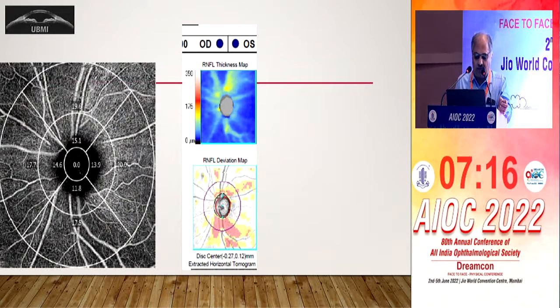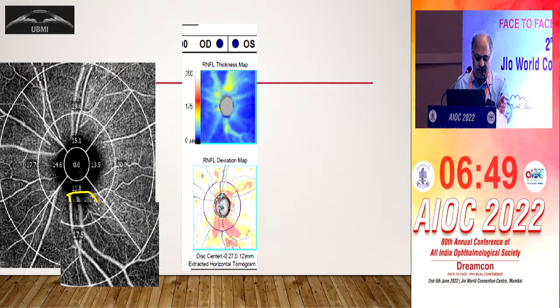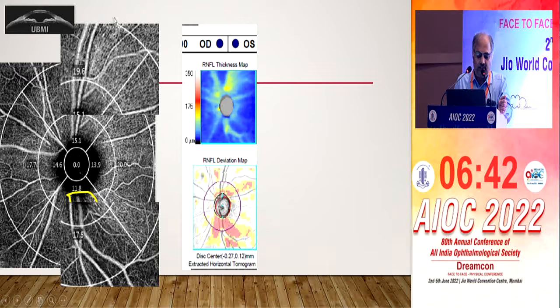Another case, actually, of the glaucoma on the other eye of this patient, you have a structural change seen on OCT. And does it correlate with what we see on angio? Yes, it does. If you see, you can see the branching vessels over here, but the radial peripapillary capillaries are seen at this edge from this edge. It is not seen in this particular area, but it is seen superiorly. So this is the area where it is deficient. I have just enlarged this image to show that you can see only the superficial plexus and not the RPC. But they are seen in the superior quadrant.